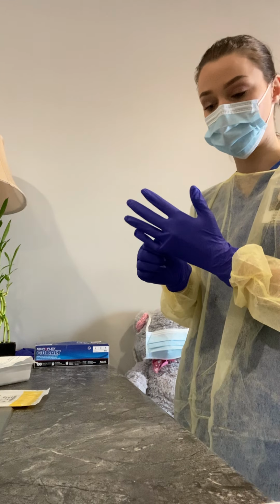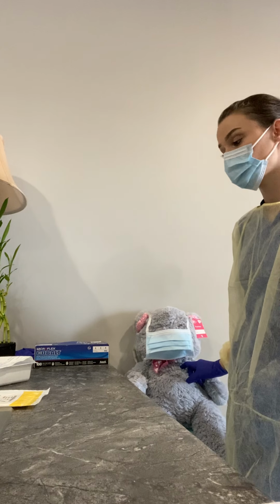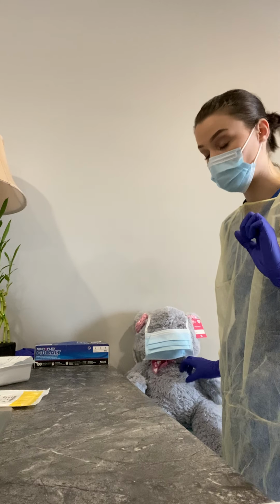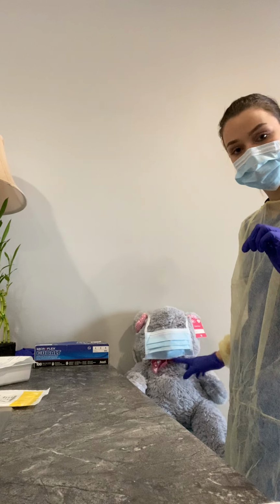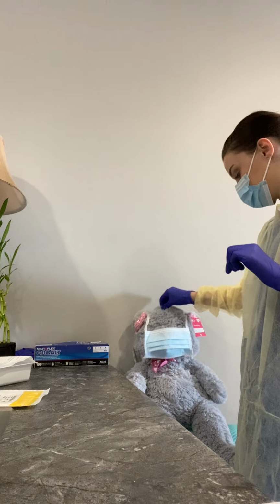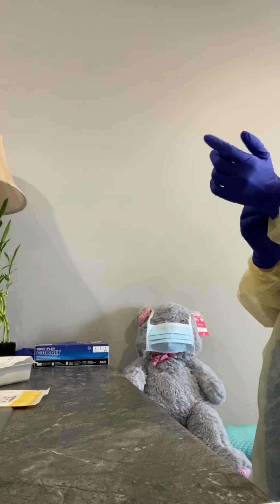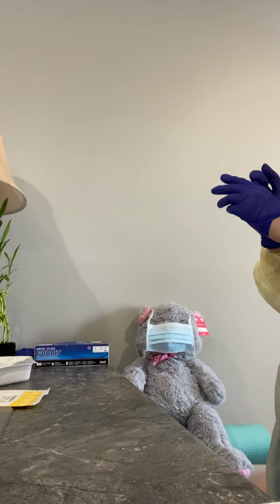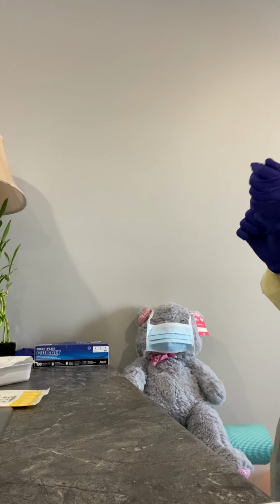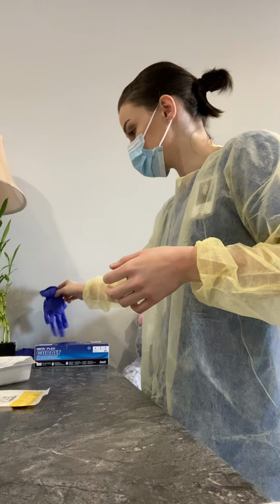Alright, so I've got my clean gloves on. And I'm just going to feel where her port is. So I'm going to note the top and the bottom of the port. Feel where it is so I know. Okay, so I've located that. I'm going to go ahead and put on my sterile gloves and get my sterile field ready.